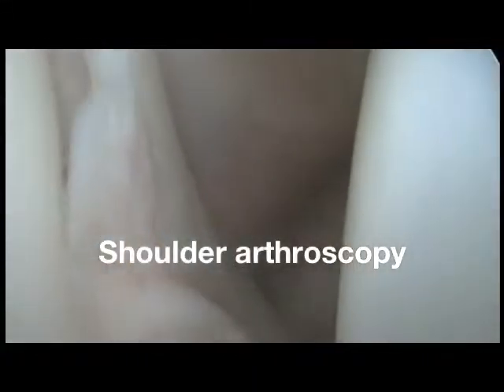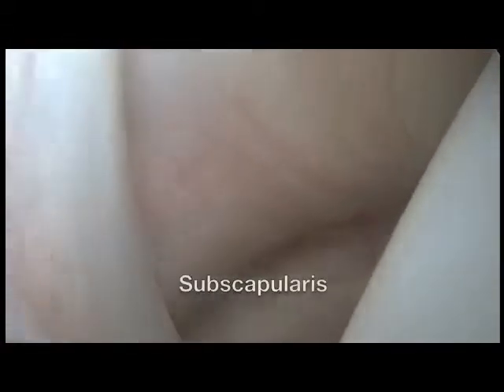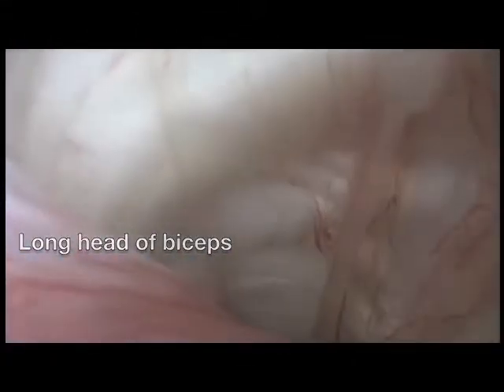This is a normal shoulder arthroscopy. We see the humeral head on the right and the glenoid, the socket, on the left. More anteriorly is the subscapularis muscle and tendon and its upper end. This is the medial sling and the long head of biceps, which goes into the bicipital groove at the side of the humerus.